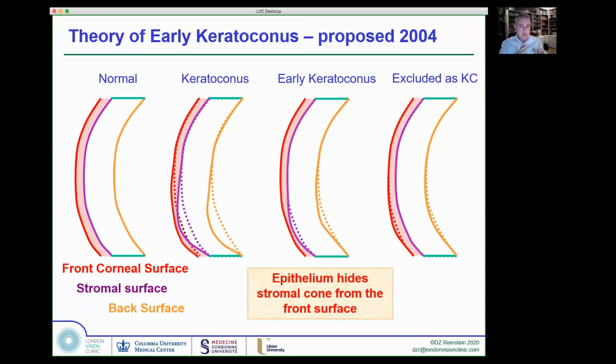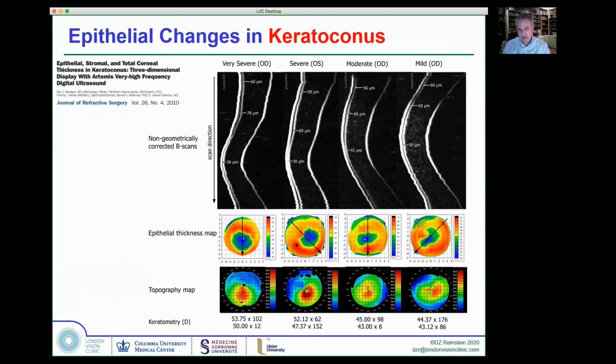And this raised eyebrows, because in a study that we did, we showed that out of 1,500 eyes, about 10% were suspect. We did epithelial maps on those with high-frequency ultrasound and found that in 84% of the cases, the corneas were deemed to be normal, and we did LASIK on them. So the argument now became you need an epithelial map to rule a cornea in for surgery, as opposed to just trying to find these needles in the haystack where the front surface is normal and the back surface is not. So avoiding a complication isn't what sold the epithelium, if you like. What sold the epithelium to the industry was the fact that you could do more surgery by excluding keratoconus. It's an interesting story from a marketing standpoint.